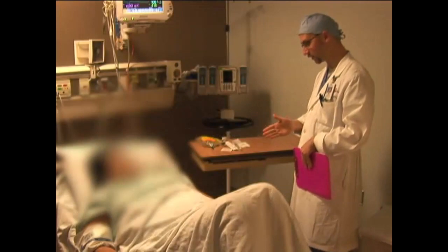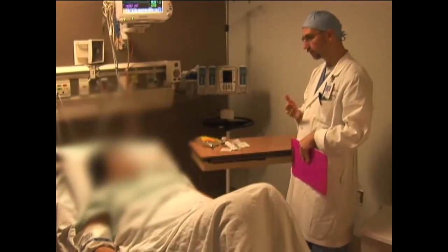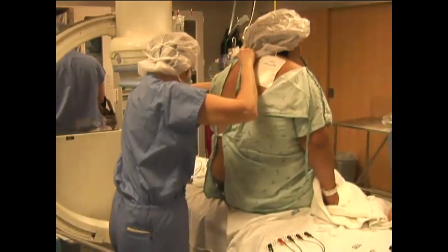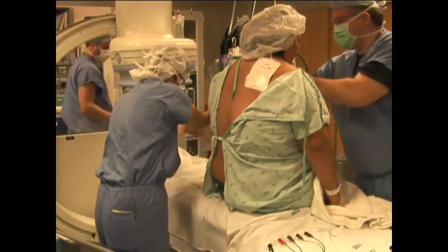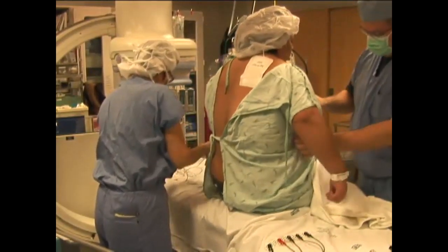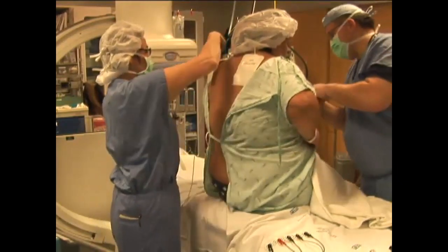Informed consent is obtained while discussing the plan for the procedure as well as the risks involved. The patient is brought into the electrophysiology laboratory and defibrillation patches, grounding pads, ECG leads, blood pressure cuff, and oxygen saturation monitor are applied.